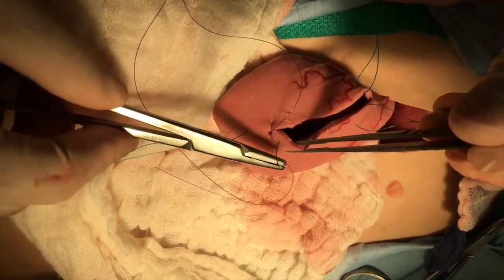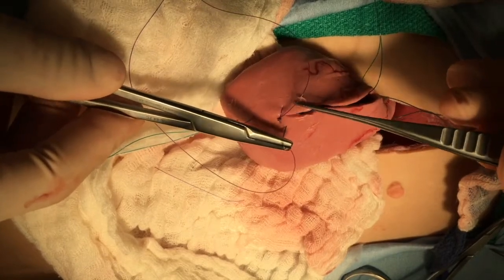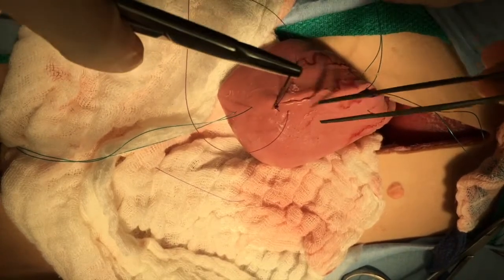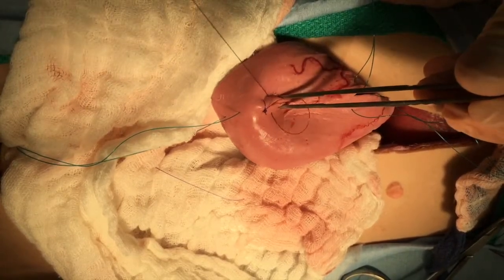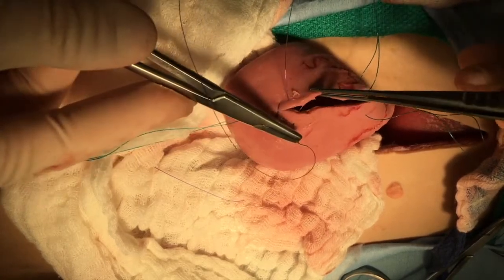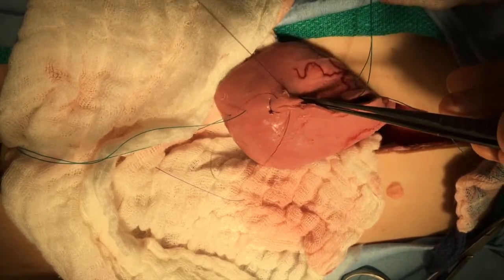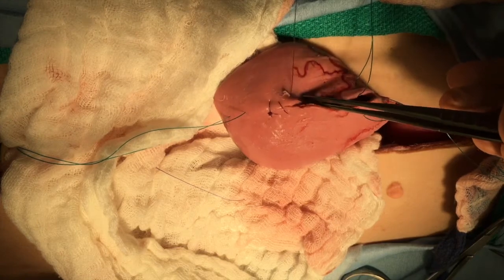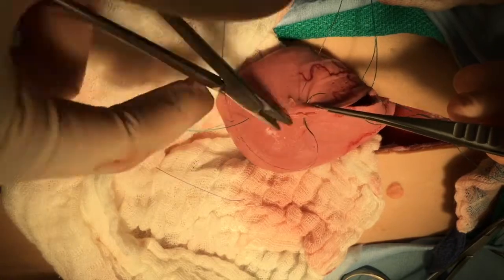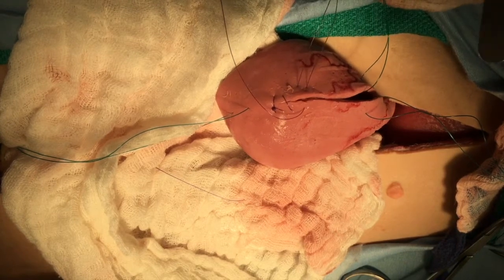Using rapidly absorbable monofilament suture, size 3-0 or even 4-0, a simple continuous pattern is used to close the cystotomy site. Be sure to use a tapered needle — we do not want to use a cutting needle. Margins are carefully manipulated with DeBakey forceps, and having an assistant maintain a little bit of tension as you take the bites can help maintain appropriate tissue acquisition.